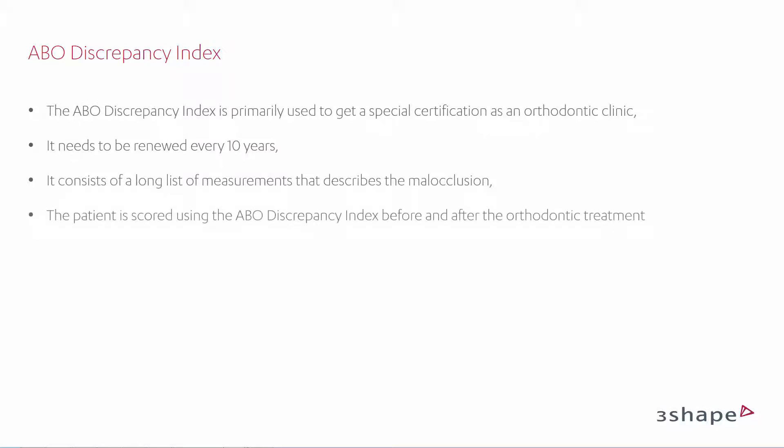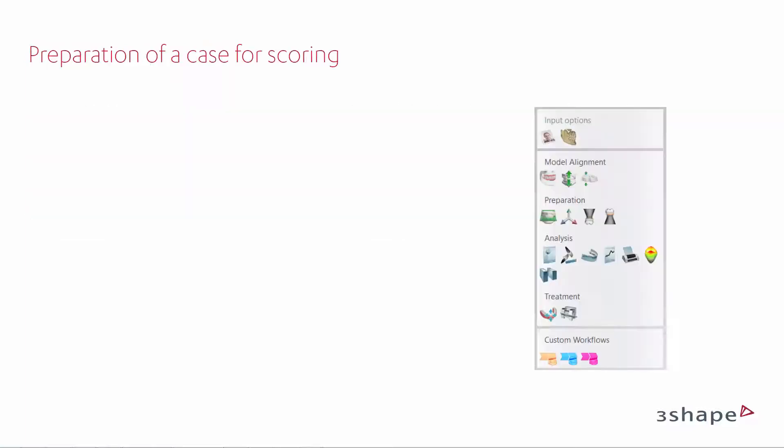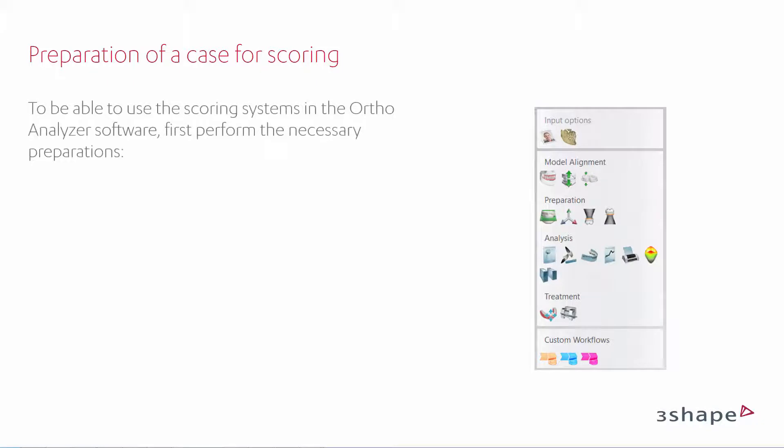The patient is scored using the ABO Discrepancy Index before and after the orthodontic treatment. You also have to remember to prepare the case for ABO scoring.